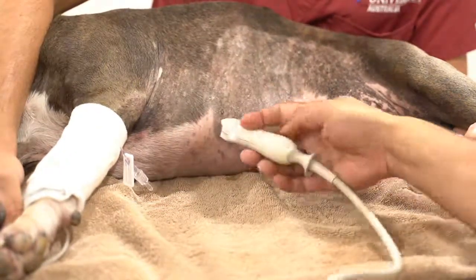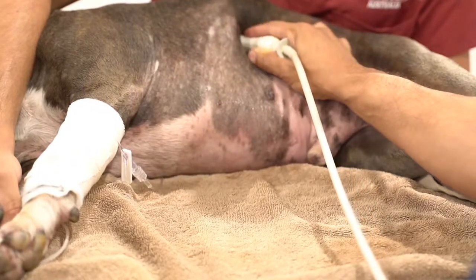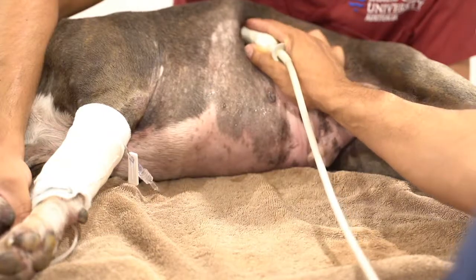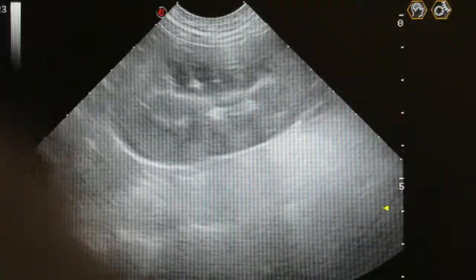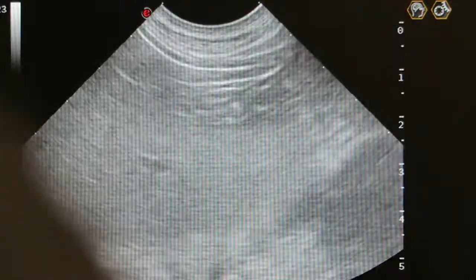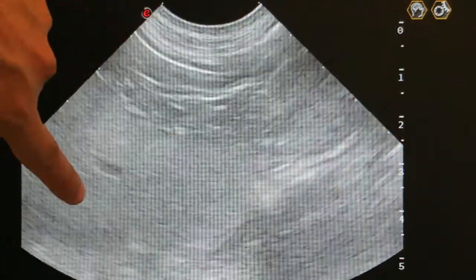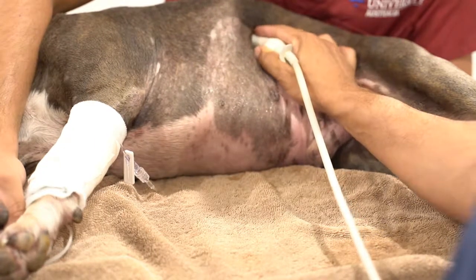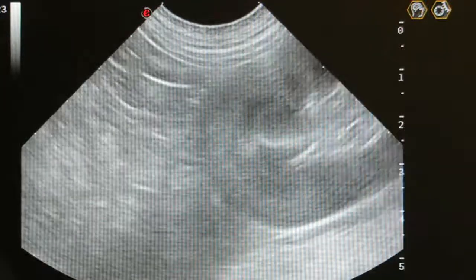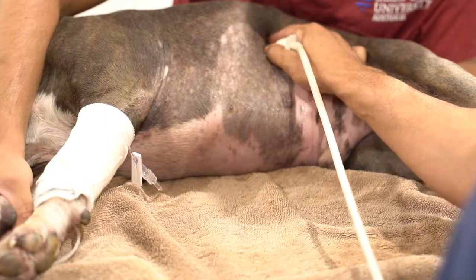Score of 0 for that area. Moving to the splenorenal site, off the lateral body wall. We want to find the kidney — adjust the depth so the kidney fills the screen. Fan around the cranial aspects of the kidney. This is the kidney and this is the spleen. Fanning back and forward around the kidney and spleen area, looking for free fluid — no free fluid, no black triangles, no fluid between those structures. Splenorenal site is 0.